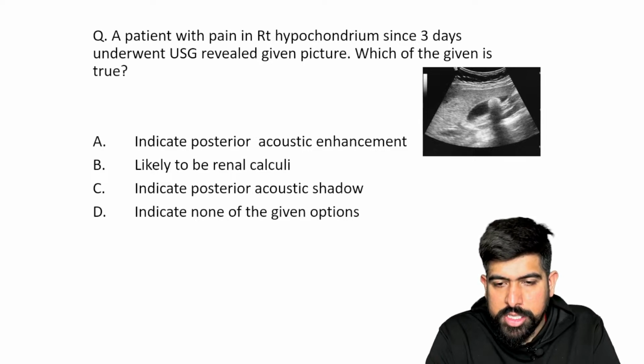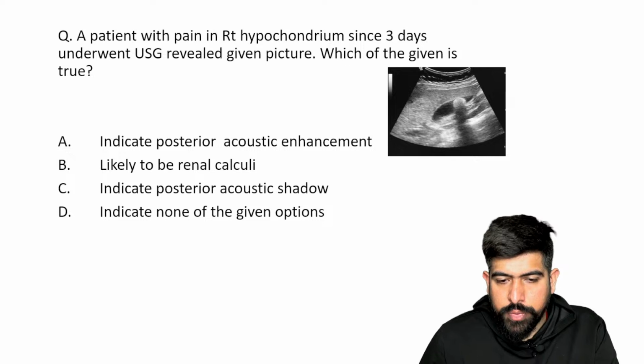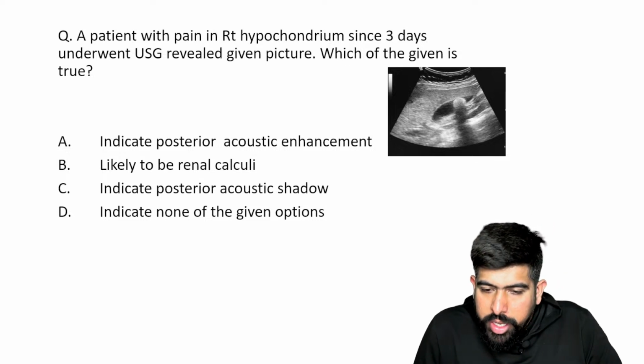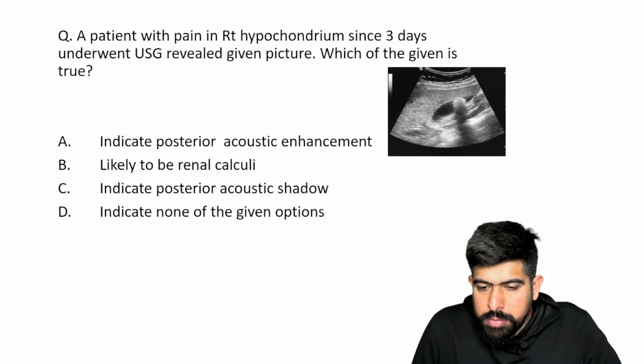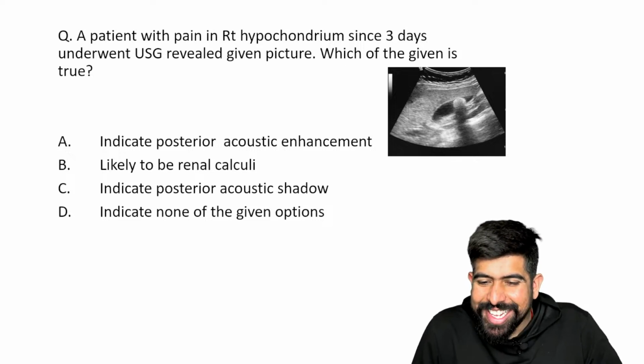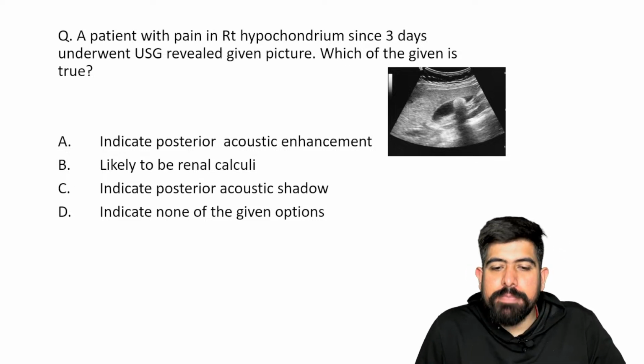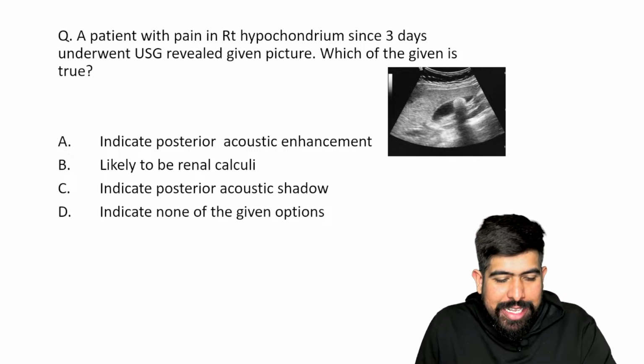Now tell me guys, what is your diagnosis in this condition? This USG is shown to you. Sorry for the disturbance. Okay, posterior shadow, you are asking or telling me? Very good. Gallstone, yes, gallbladder stone. Agree with you. Okay, let's talk about it.